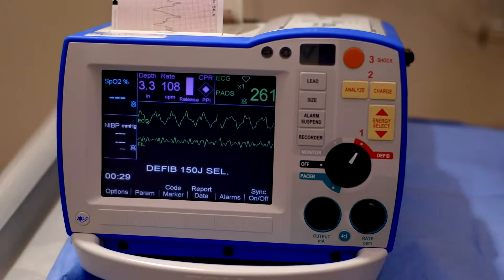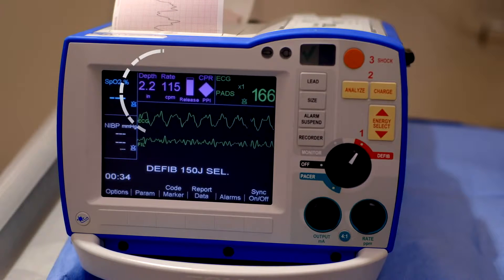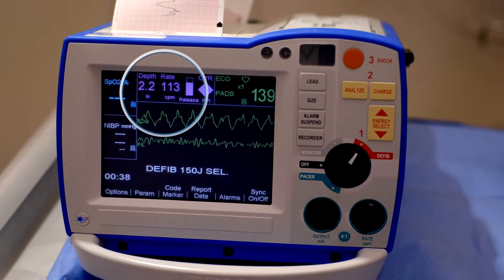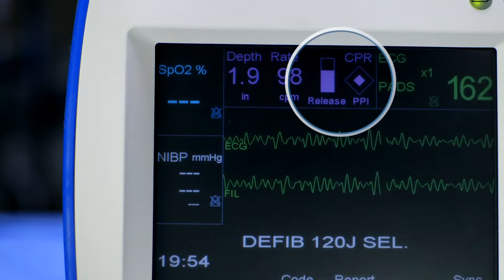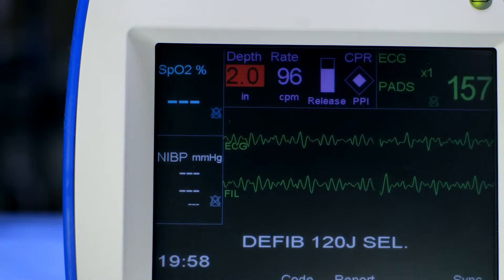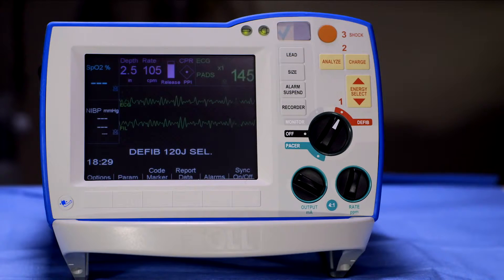For adult patients, real-time feedback displayed on the CPR dashboard includes: compression depth indicator, compression rate indicator, release bar, perfusion performance indicator (PPI), audio and messaging prompts, and idle timer. The CPR dashboard on the R-Series defibrillator provides you with a digital reading of each and every chest compression.